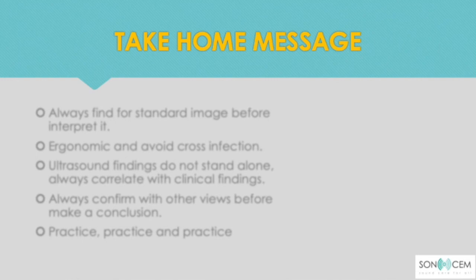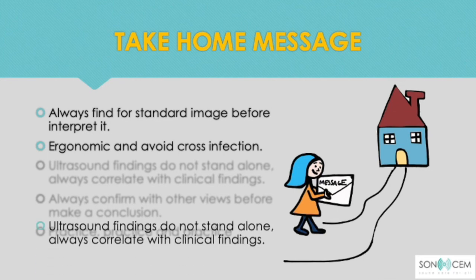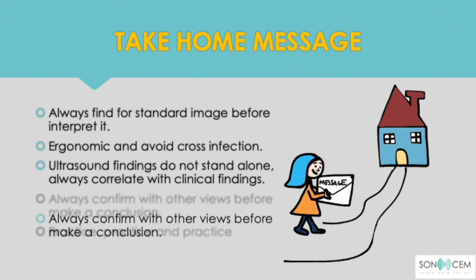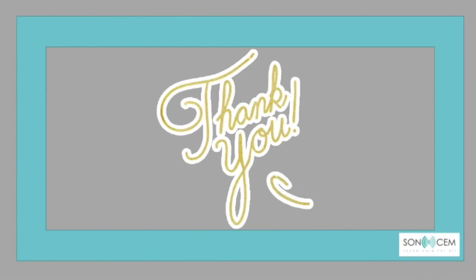So, take home message. Always find the standard image before we interpret it. Ergonomics, and avoid cross infection. Ultrasound findings do not stand alone. Always correlate with clinical findings. Always confirm with other views before making a conclusion. Practice, practice, and practice. Thank you.